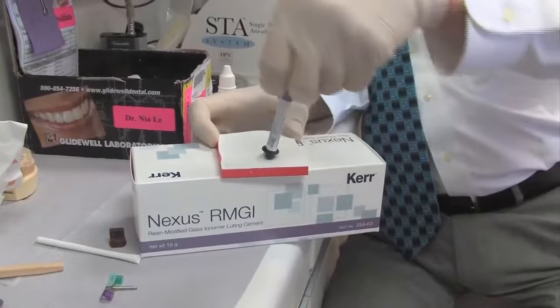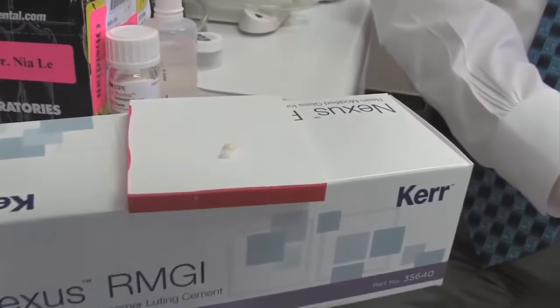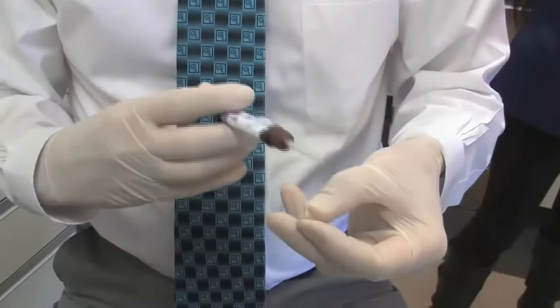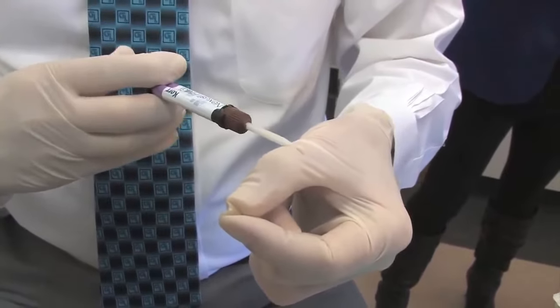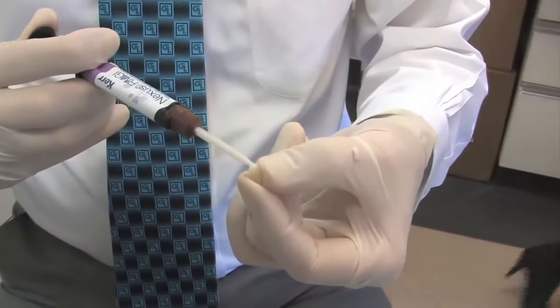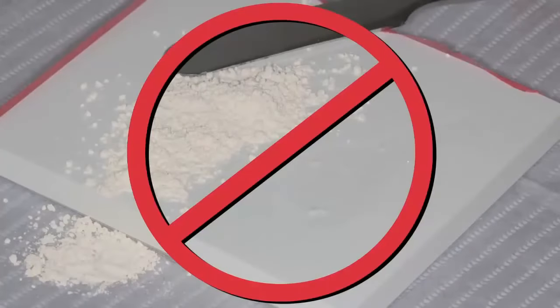That's going to help the resin in our Nexus RMGI bond to the crown. We're going to bleed a little bit out of the tip — it's an auto-mix system — and as a result, it doesn't get much easier to mix cement. I just put one little dot from the end of it on my glove, and then we're going to fill the crown.